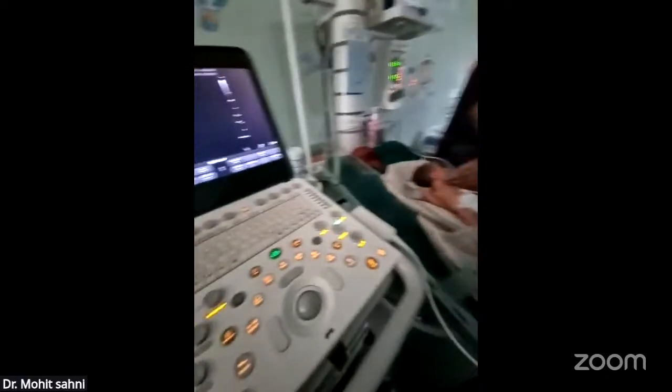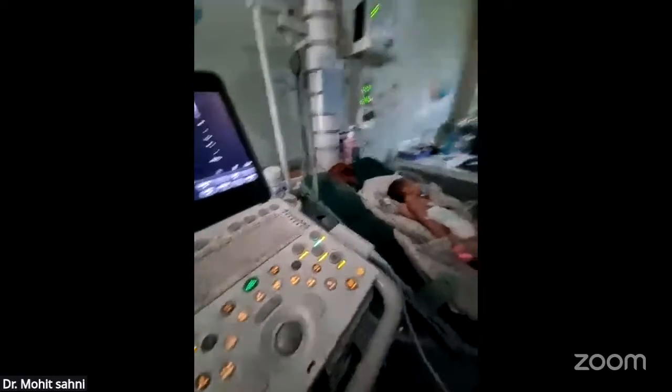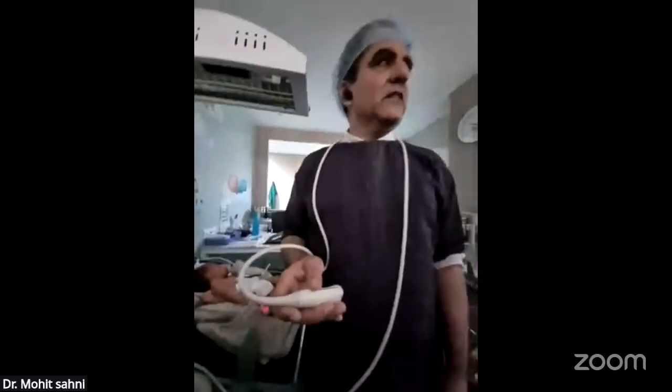If not, then we will go for sagittal sections. I hope I have mentioned all the structures.